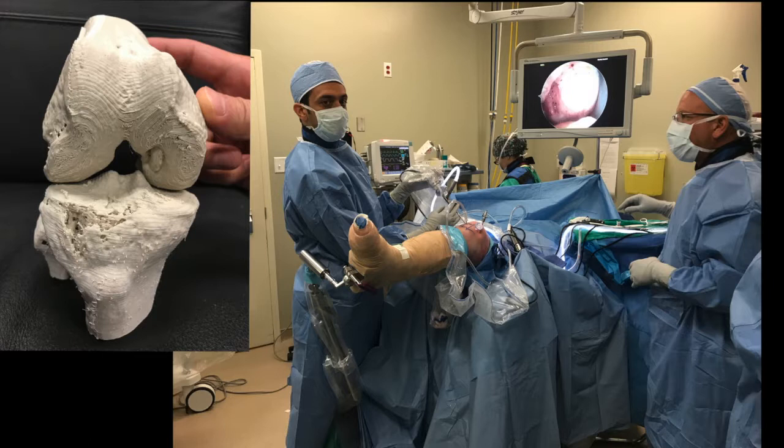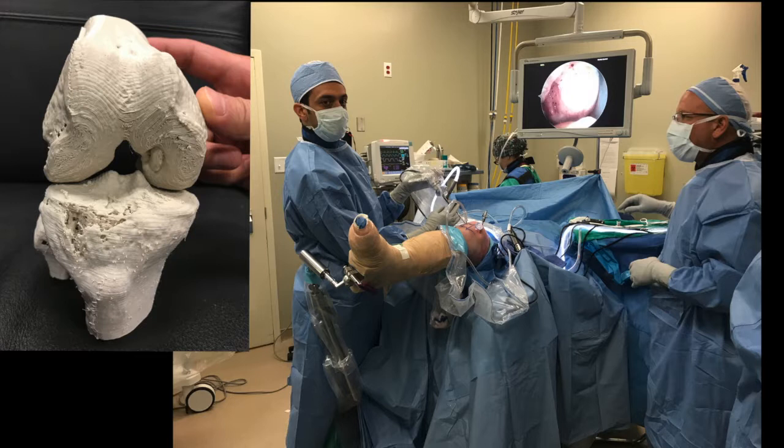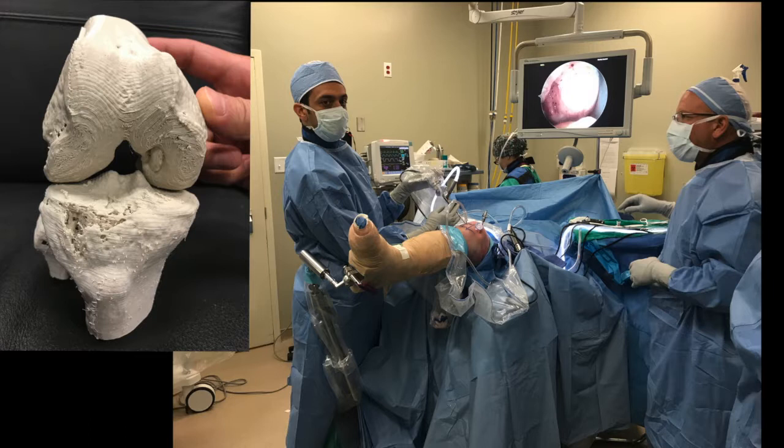The knee is flexed 45 degrees while the hip is flexed 45 degrees and abducted 20 degrees with 30 degrees of external rotation, to allow the defect to be as horizontal as possible.